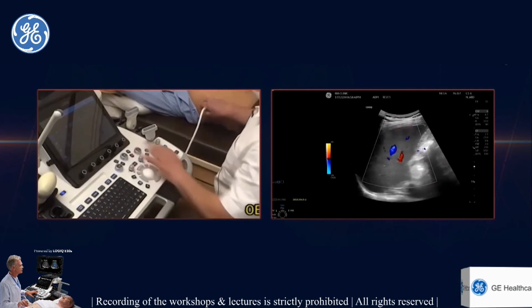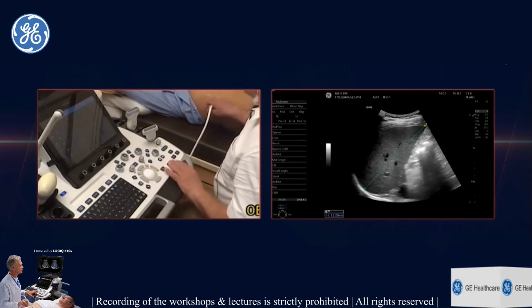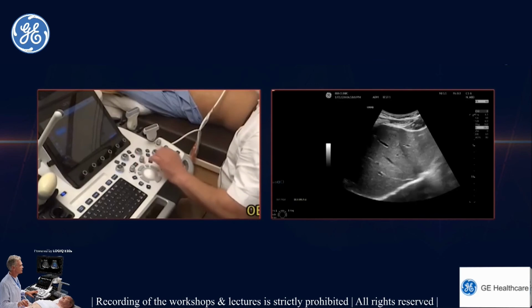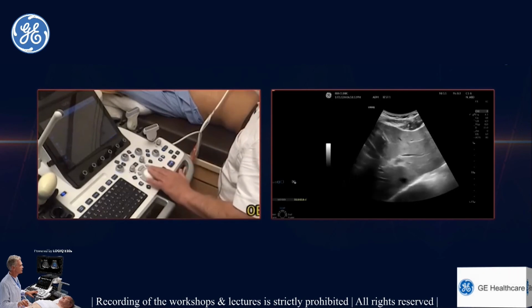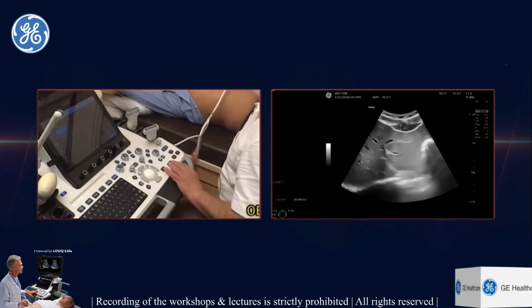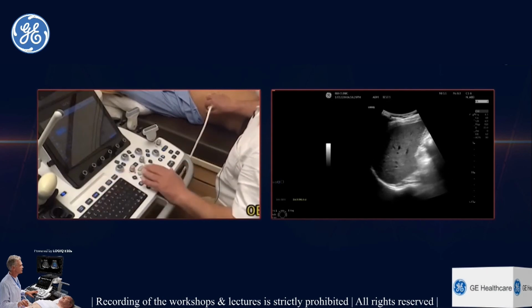And then once we have seen the liver, we always measure the right lobe liver. And then we see in transverse section. So we look at eyeballing the essential contours of the right lobe and the right lobe caudate lobe ratio. So here, of course, the liver looks essentially just marginally bright. There's no evidence of chronic liver disease. So we will straight away go for the elastography.